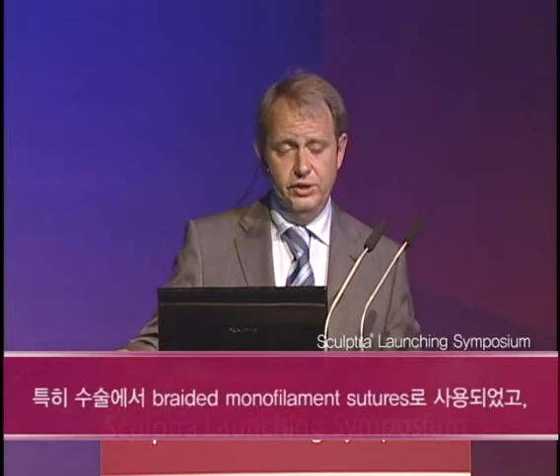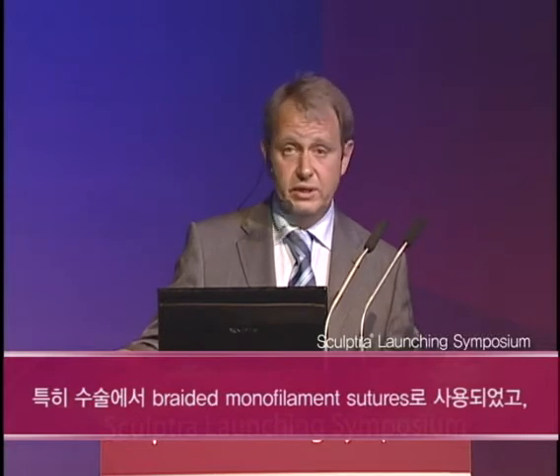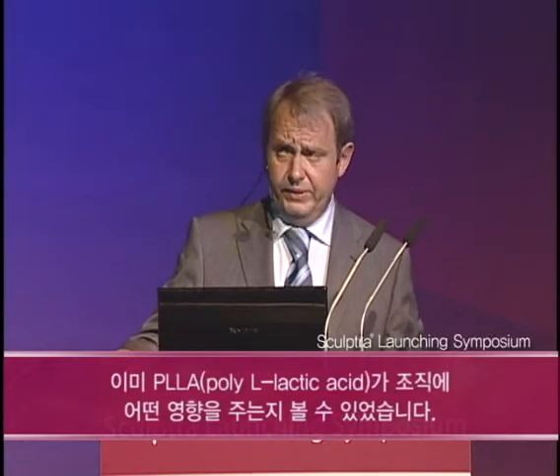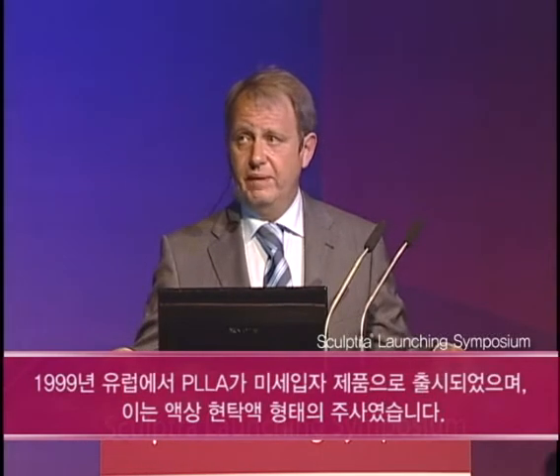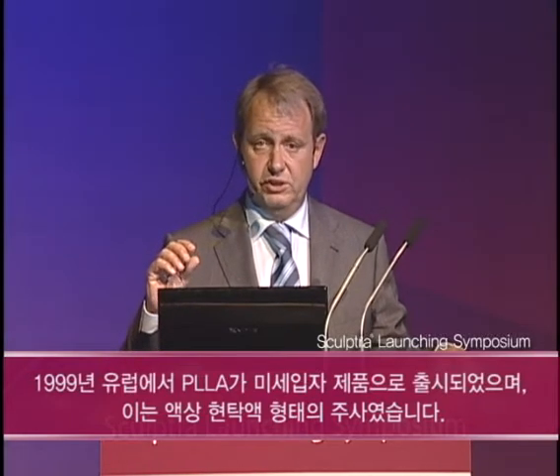A little bit about the history of PLLA. It's not something new. Polylactic acid was synthesized in France in 1954 and used especially in surgery, in braided and monofilament sutures, but also craniofacial surgery and orthopedic applications in screws, plates and membranes. And in that time, they already observed an influence on tissue from the polylactic acid. In 1999, the product became available on the European market as a microparticle product in a watery suspension for injection, but was put on the market as a dermal filler.